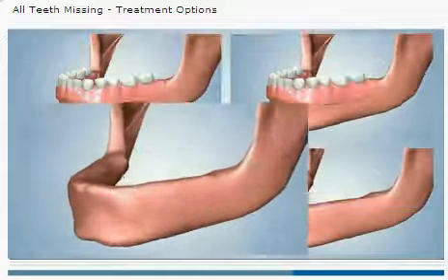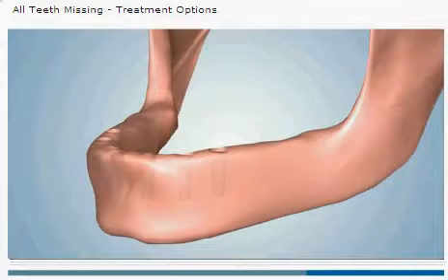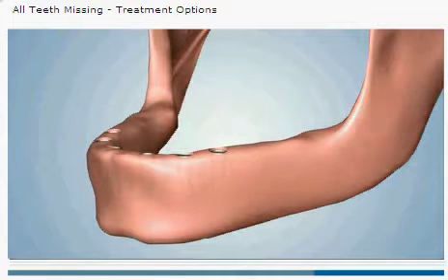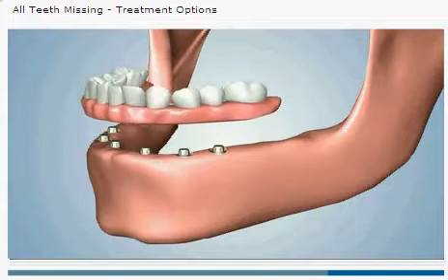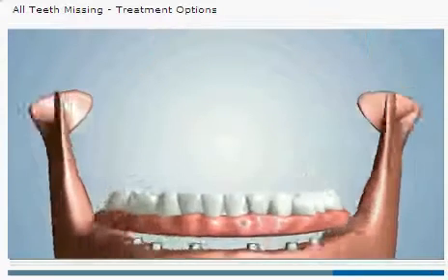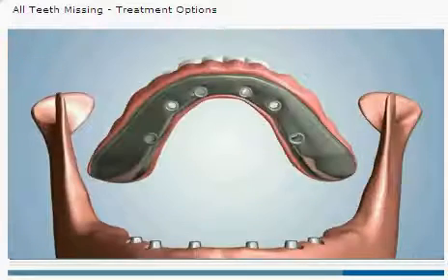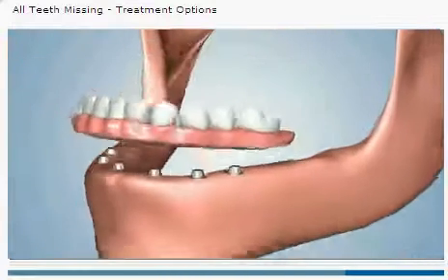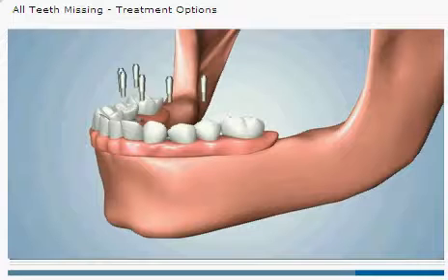A third option involves the placement of five or six dental implants. Specialized attachments cover the implants to facilitate the placement of what is known as a fixed detachable denture. The denture is designed with small holes that allow specialized screws to pass through and connect directly to the implants. This is a very stable and secure treatment option that can only be removed or detached by a dental professional.